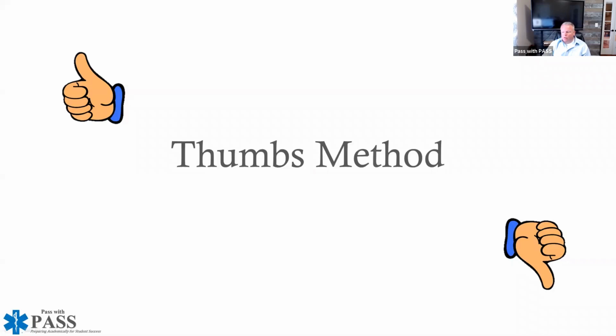All right, any other questions about what we've talked about up until this point? What we'll do is we'll go through the thumbs method, and then after the thumbs method, we'll have 3 or 4 of these that we can look at and put into practice, so that you can use the hexaxial system, or you can use the thumb system, to figure out which quadrant you think these patients are going to be in. So any questions at all? All right.